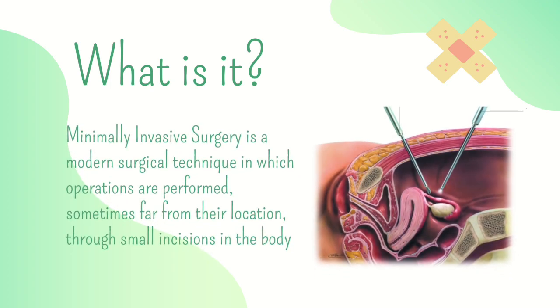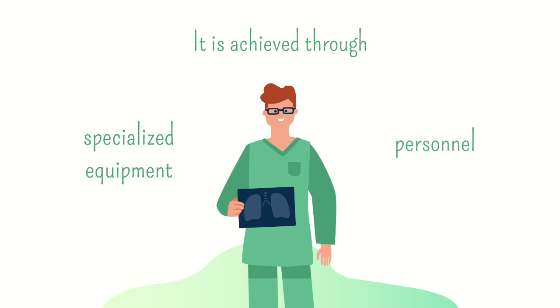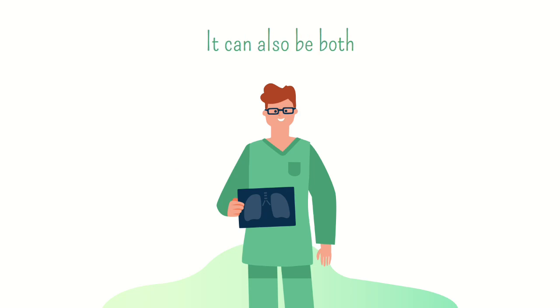So what is MIS? Minimally invasive surgery is a modern surgical technique in which operations are performed, sometimes far from their location, through small incisions in the body. It is achieved through both specialized equipment to visualize and manipulate the body's organs, and a team of personnel equipped with laparoscopy knowledge and trainings. Laparoscopy can be both diagnostic and therapeutic at the same time.